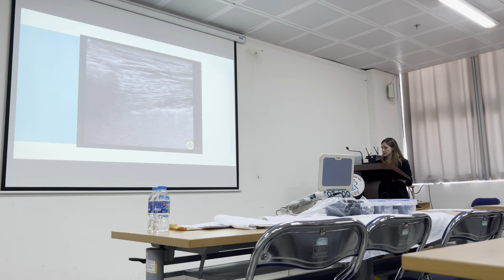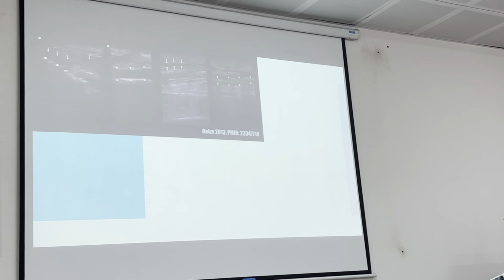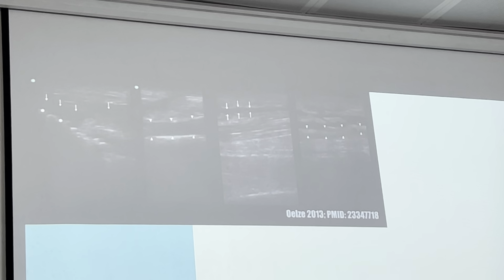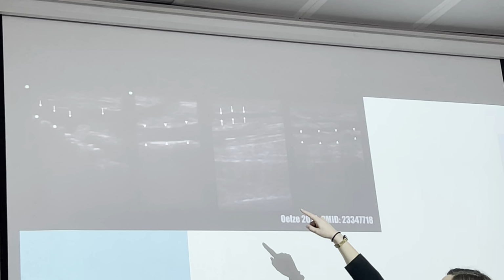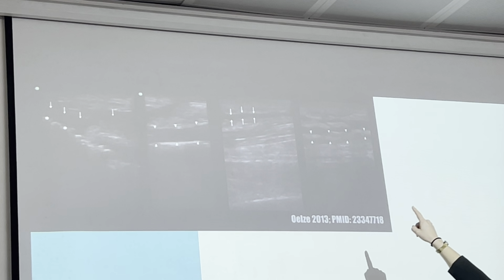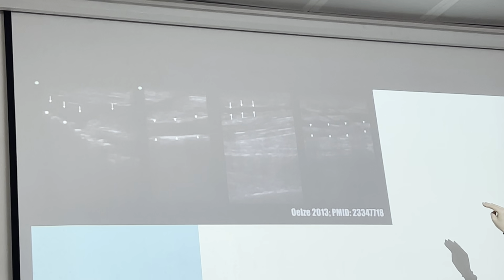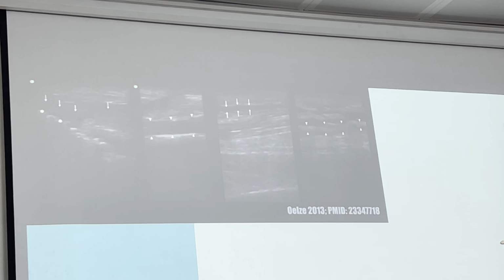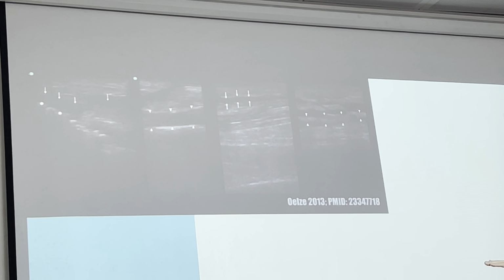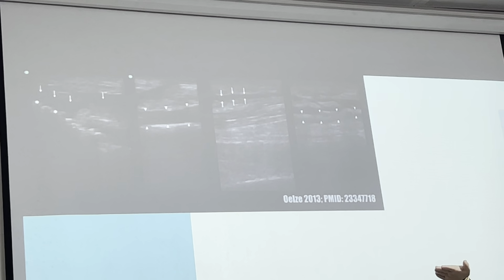So look at that. This is more what we talked about with that fluid stripe. In that second picture, you're starting to see some air. It's hard to tell from here if you're getting some of that posterior shadowing, but here you can see that the fluid, that hypoechoic area, the dark area, is more layering, and especially tracking along the fascial planes, and it's not giving that cobblestone appearance of the fat lobules. It's a little bit of a deeper infection, and concerning because it's causing almost the layering, separating effect near the fascial planes.